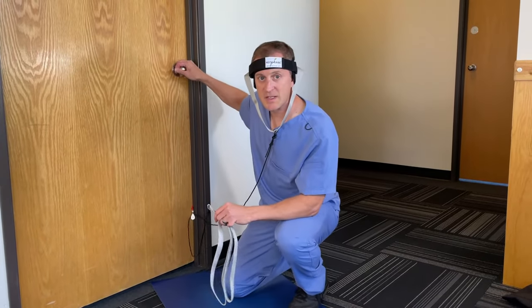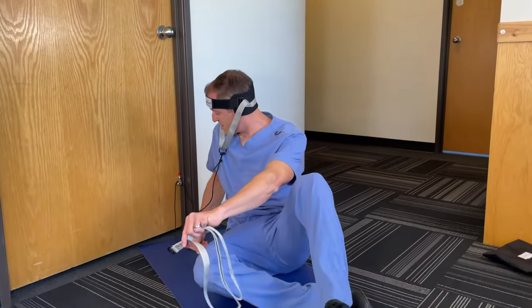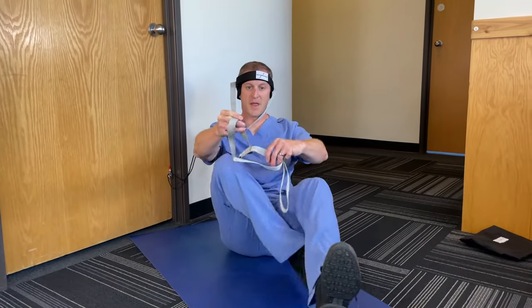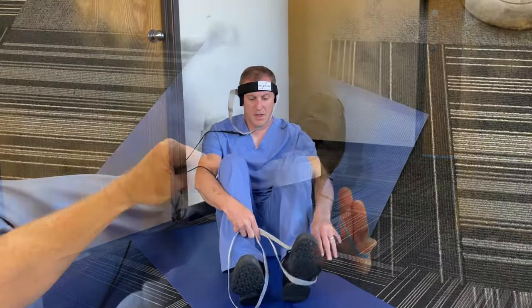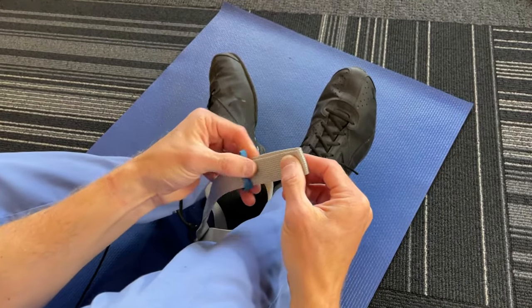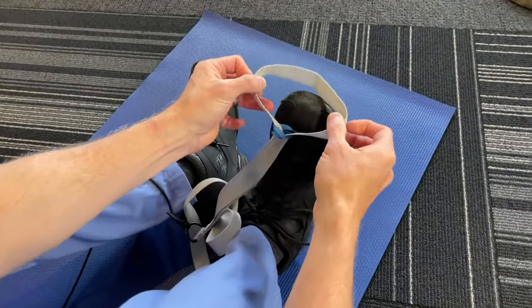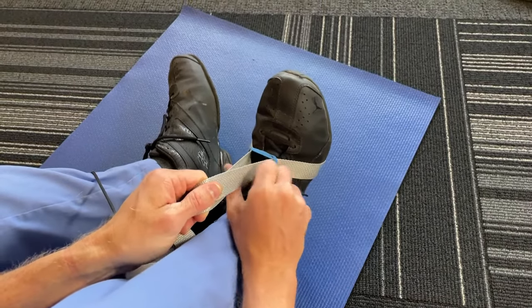Now that you've made sure the door is nice and closed securely, sit down on the floor and take the foot loops and put them on your feet. A little pro tip is to grab a couple of sturdy rubber bands to place on the foot loops as you see here. Then roll the band down to secure the loop at the ball of your foot so it doesn't slide out of place.